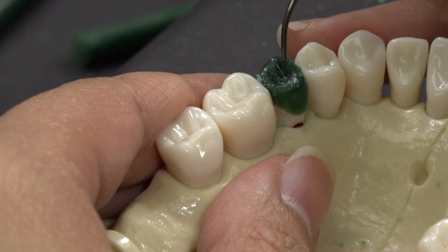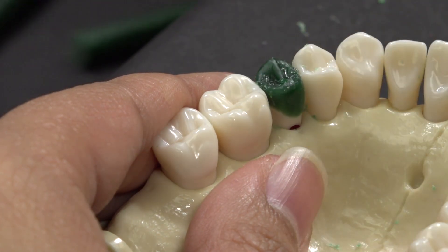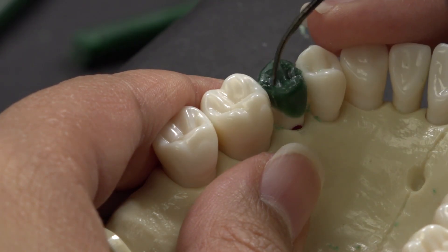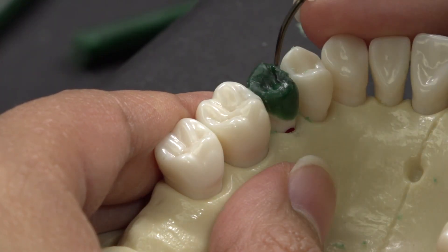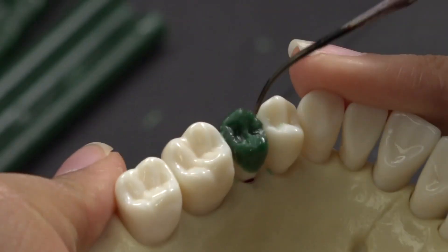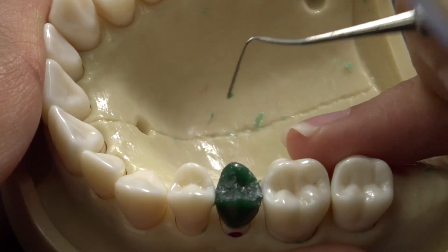I use the IPC to refine and burnish the grooves and fossa that I created with carver 3. Use a hot PKT to melt the excess wax and draw in the additional groove side triangles. Then use the IPC and carver 3 to smooth out and refine the grooves.